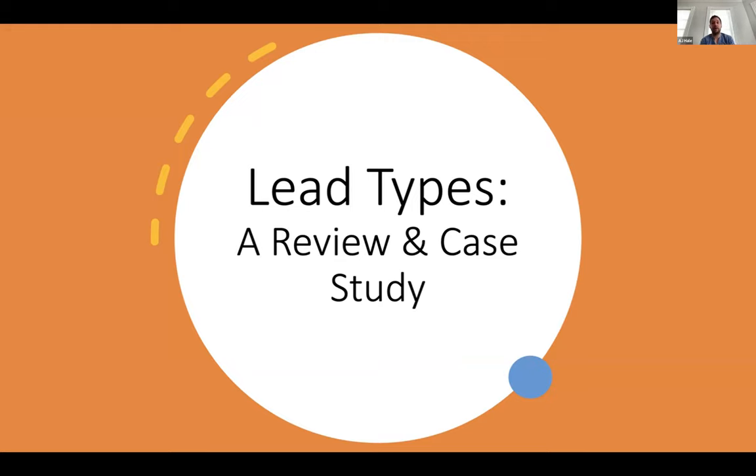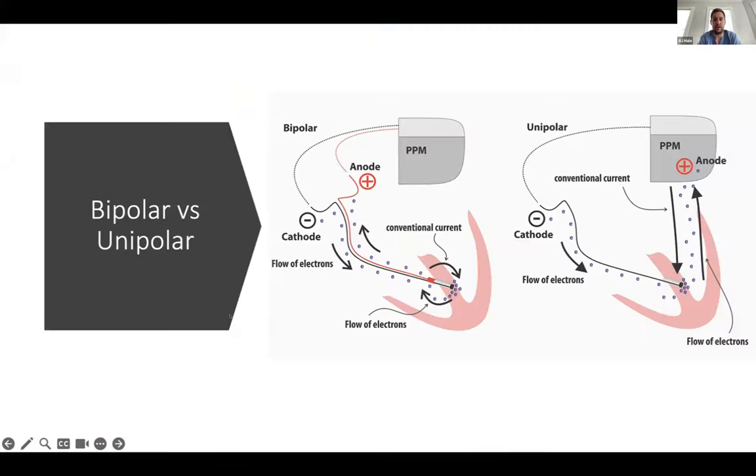Okay. Well, I'll go ahead and jump into this. I know we've taken up enough of your Sunday evening, so I don't want to take too much time here, but we had an interesting case study that Dr. Edafe referenced earlier. Then I just want to go over a general review of different lead types, specifically pins and ports. We've had this talk before, and I'm sure we can cover it again later, but it's always good to keep these salient in your mind, because a lot of times, as has been mentioned, you're going to have multiple sources of devices, from different companies and different models. It's good to keep track of what you have in your inventory and see how they can all be utilized for a patient. So let me move on here.